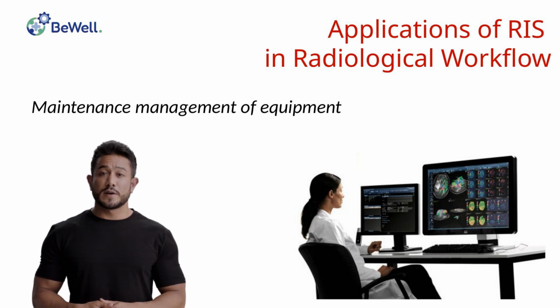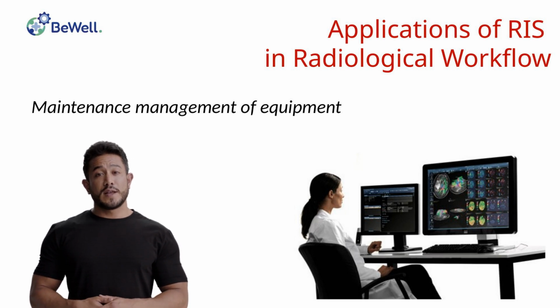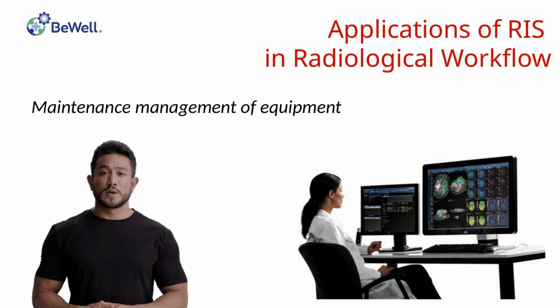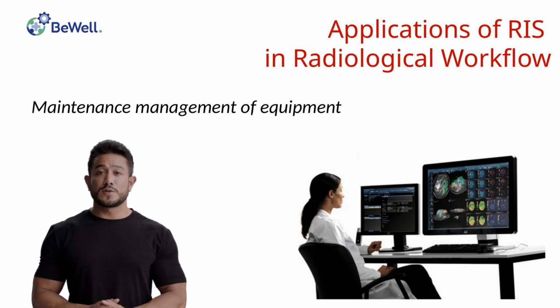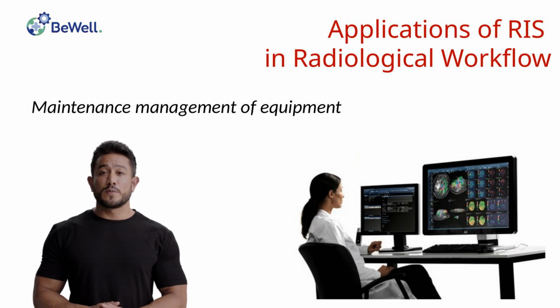In fact, the system can be notified for each piece of equipment of its usage status, workload, machine downtime, etc. It is well known that efficient management of radiological equipment cannot be achieved without accurate monitoring of their maintenance. This is not only due to the importance of having equipment in optimal conditions for clinical work but also within the framework of resource management, considering that the cost of maintenance contracts significantly impacts expenses. It is, therefore, essential to ensure that the maintenance of diagnostic equipment is adequate both technically and economically.